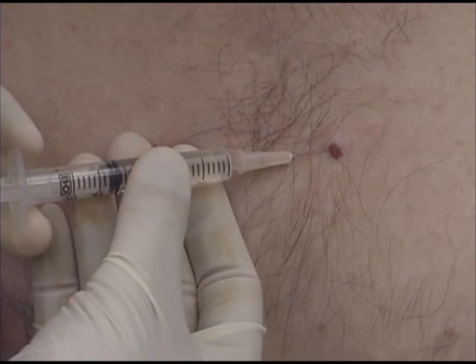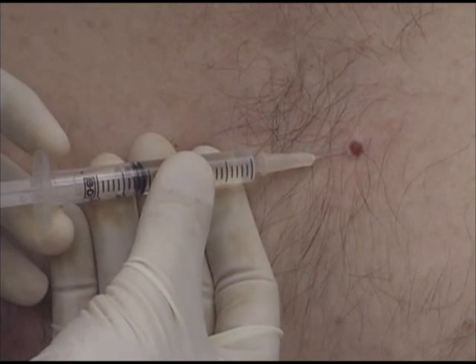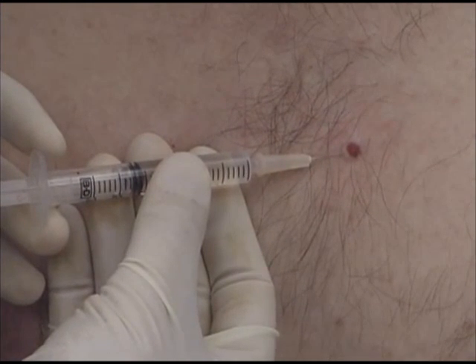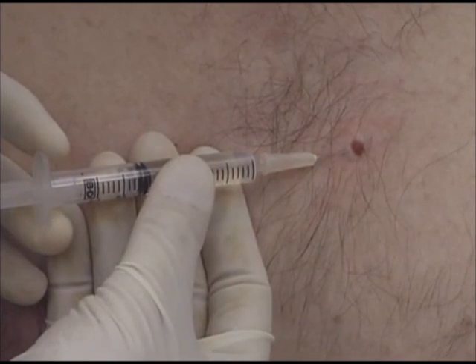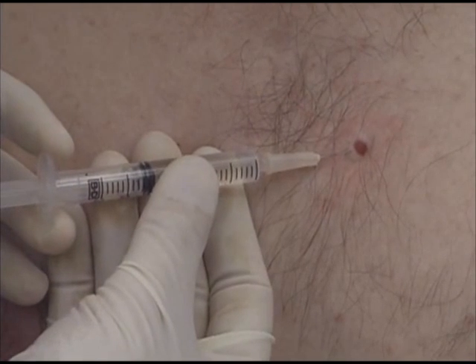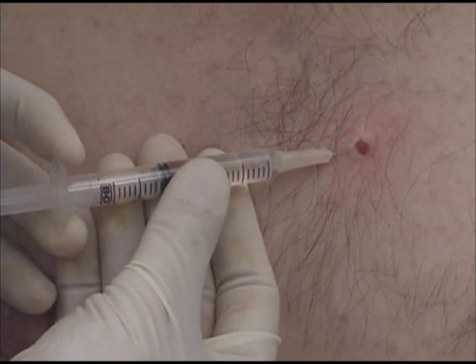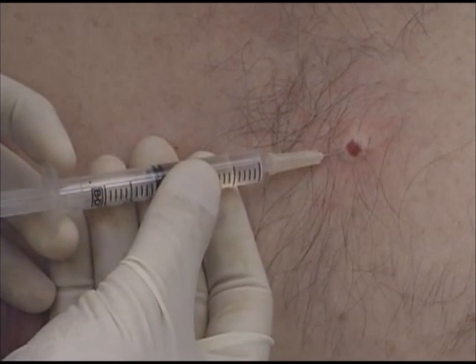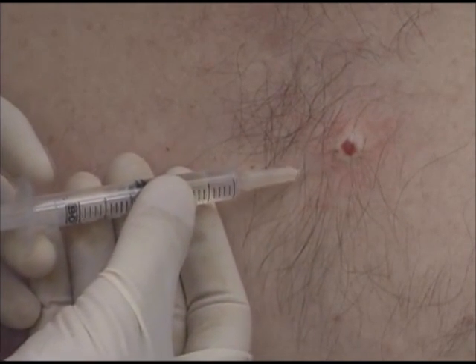I use local anesthesia for this larger cherry angioma and start with a shave excision prior to electrodesiccation. 1% lidocaine with epinephrine is injected through a 30 gauge needle to produce anesthesia and minimize bleeding. Using a very fine needle and injecting slowly will minimize the pain. The epinephrine causes blanching of the skin around the lesion and lets you know that you are anesthetizing the appropriate area. I am watching the lesion become raised, which will help for the shave excision. This is a clean procedure that can be done wearing non-sterile gloves, as long as I don't touch the scalpel with my gloves or hand, the surgical procedure remains sterile.